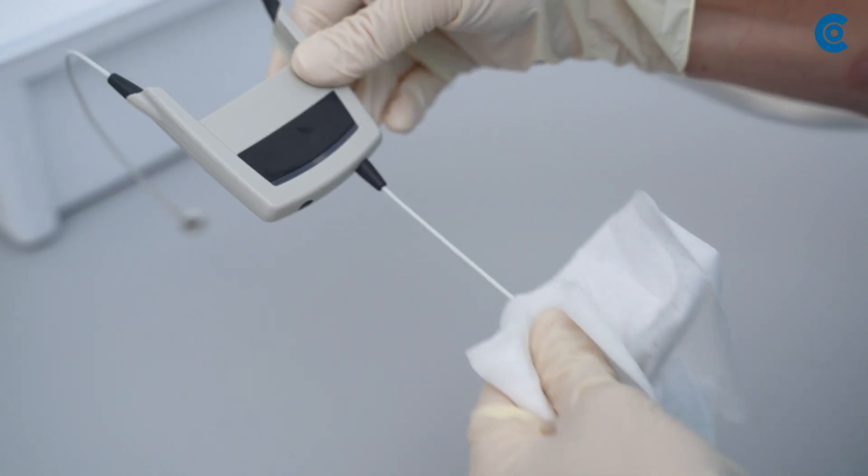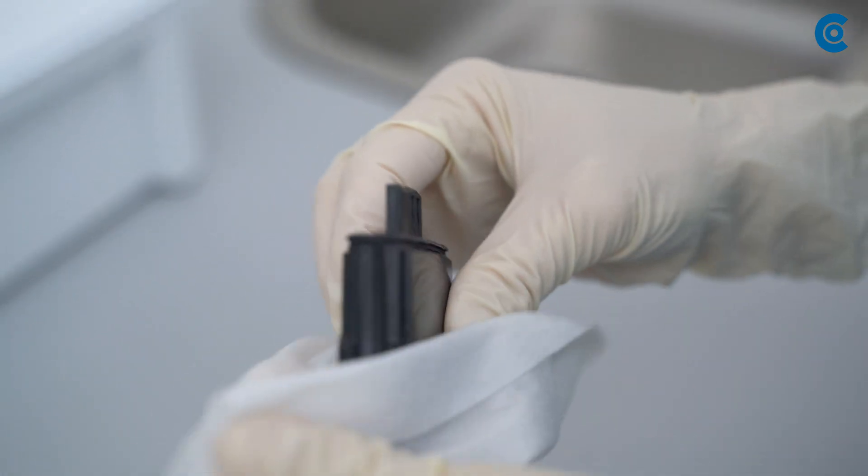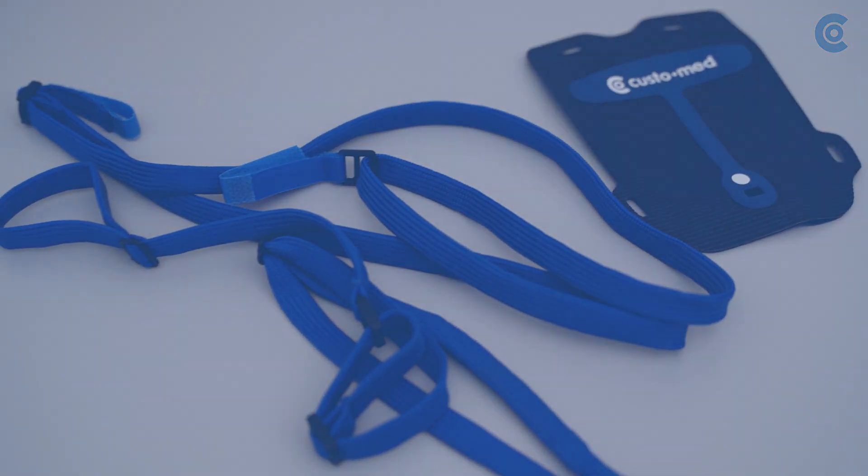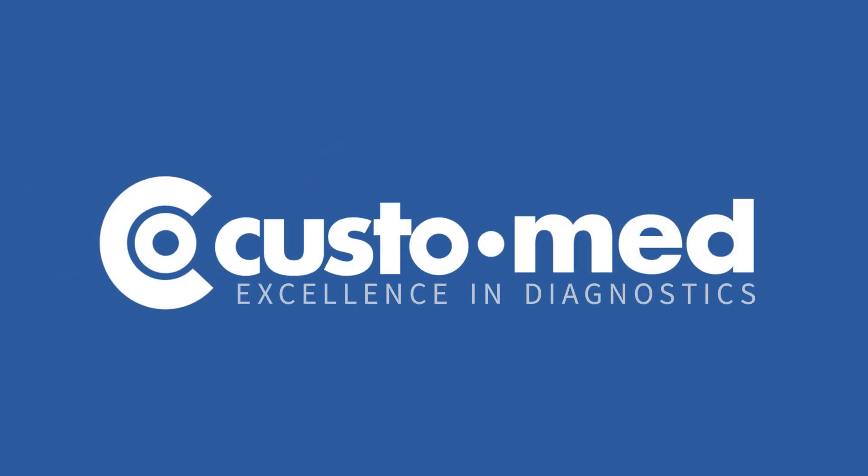Clean the Custo Flash with a disinfectant wipe and wash the carrying case and strap in a laundry net for disinfection. CustoMed – Excellence in Diagnostics.